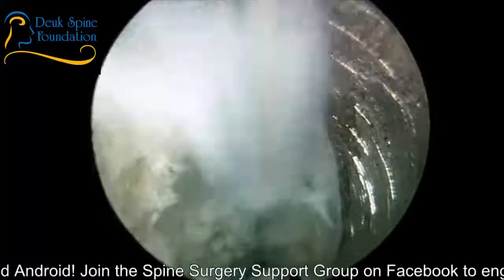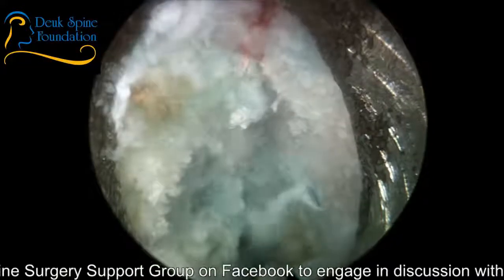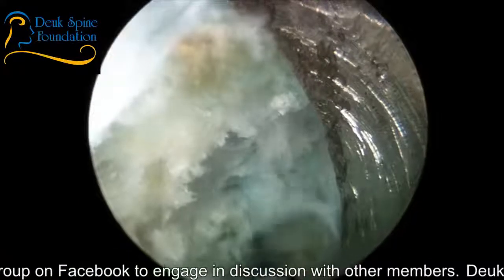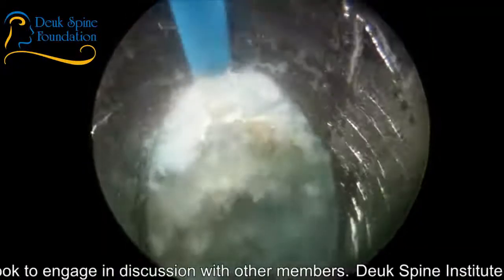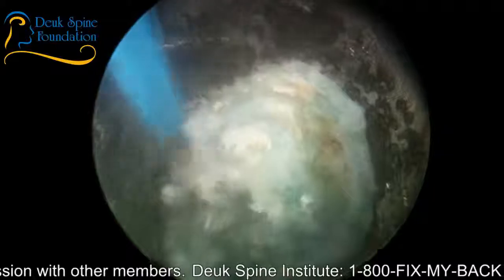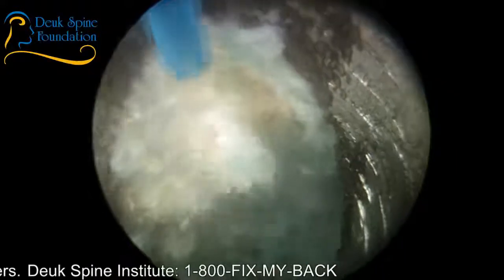All right, so we're making some progress, but you can see there's a big wad of herniation right there. What you're seeing on the right, the pinkish surface, is the end plate of S1. And I need to focus my attention on the herniation because we're starting to get closer and closer to removing the base of it a little bit at a time. And I got to free it up from the scar tissue. This is the scar tissue. And then what I'm trying to do is break it up a little bit at a time. As a matter of fact, I'd like for it all to come out at one time.